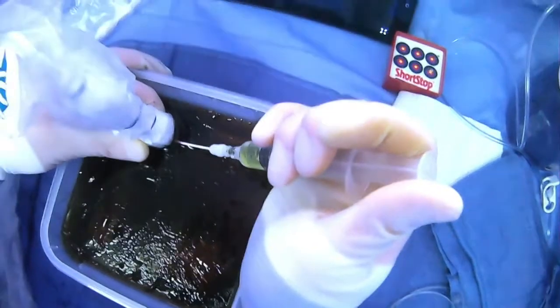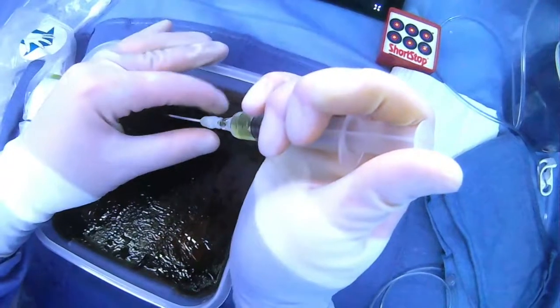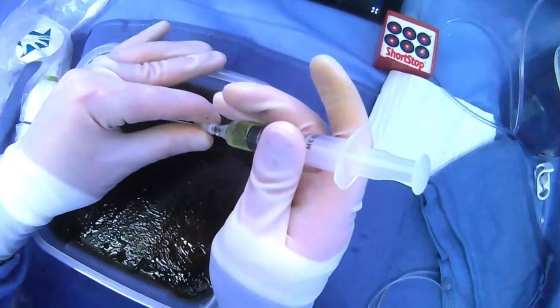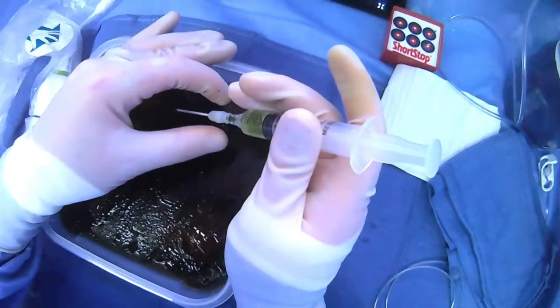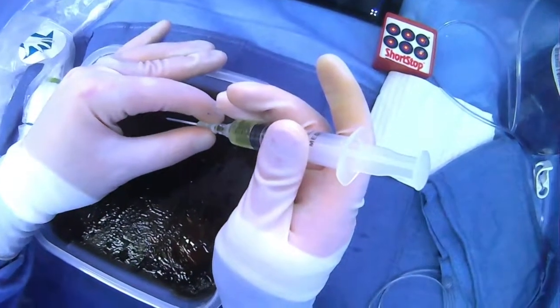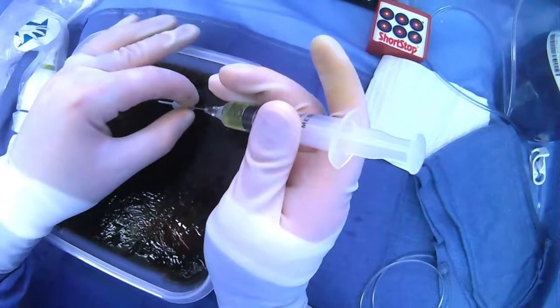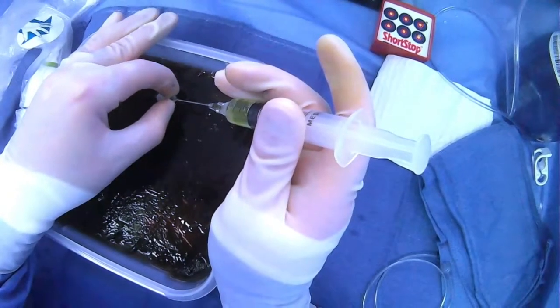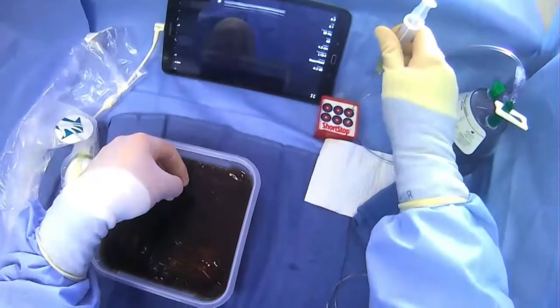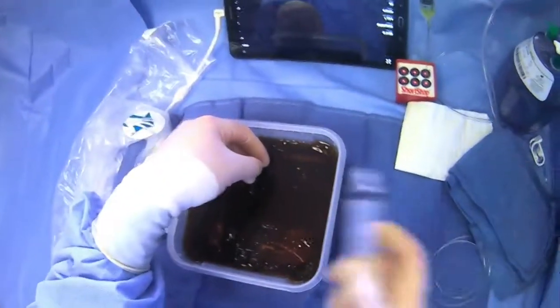You can do this under ultrasound, but I'm going to drop the ultrasound probe and readjust so I can hold my needle very, very steady. I don't want it to move forward or backward because I'm not doing this under image guidance and I don't want to lose access. Then I'm just going to slide the catheter off the needle, keeping the needle stable, and as I take the needle out I can bury my sharps and cover the catheter so I don't lose any ascites or spill it anywhere.